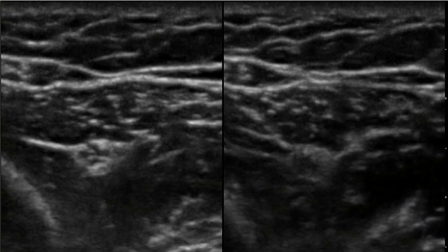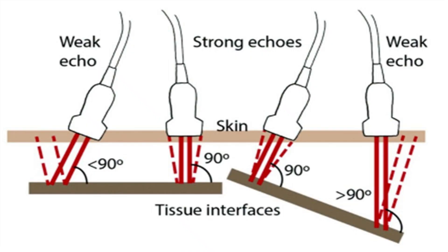As expected from the probe and beam angle position relative to the nerve, the nerve image on the left can be easily seen compared to the image on the right.